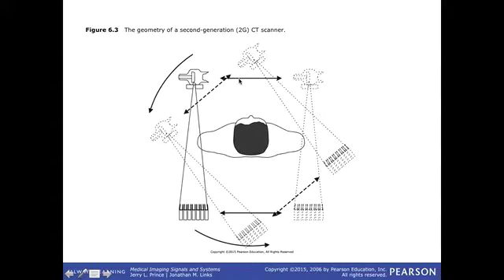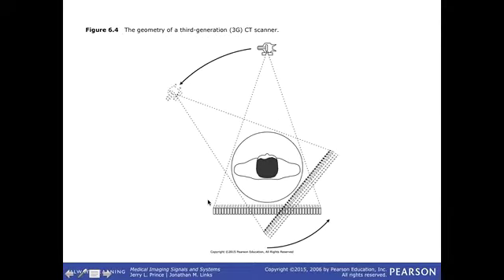And a way of speeding this up, that was the first generation of scanners, and that was done by, you know, Dr. Liu told you about Godfrey Hounsfield. He won the Nobel Prize for basically coming up with this whole ability to do this. And the first commercial machine actually did something like that. To speed it up, you could let the X-ray source have some width, like a beam, like this, and then put multiple detectors down here. So instead of just detecting one spot, maybe I'll detect 8. And I can go 8 times as fast, like raster along, or maybe 64, etc. So that's the second generation.